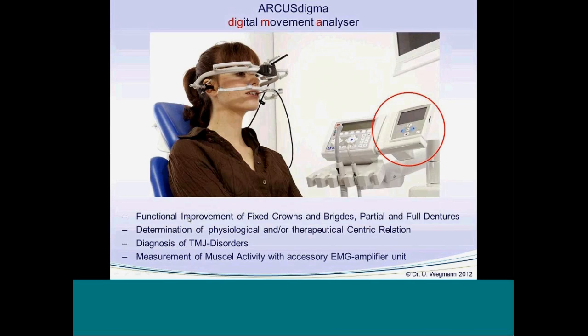But additionally, we can determine the physiological or therapeutic centric relation as well as the recording of the movements. And that's very helpful not only for the therapy of our patients, but also for the diagnosis of TMD disorders. And therefore, I will show you later on the different sections of the software for therapy and for diagnosis.